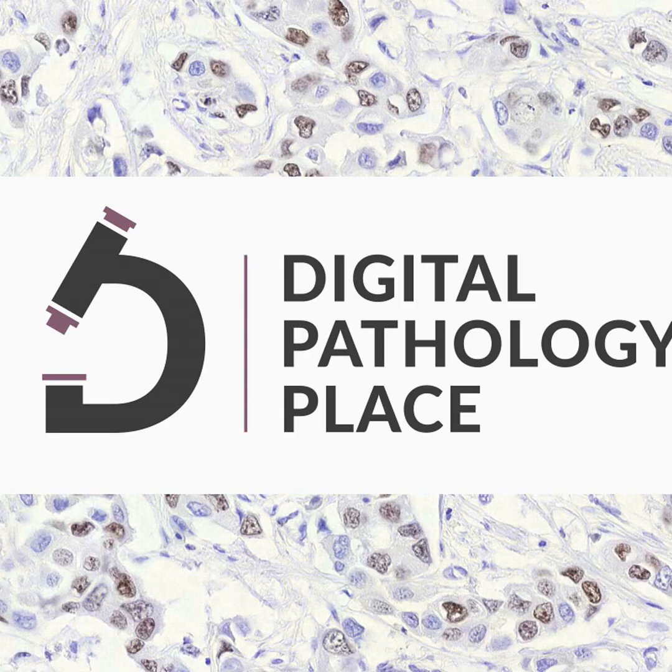This has become that much more important with deep learning, with models with millions of parameters. It's that much easier to overfit. In the more traditional machine learning days, where maybe you're looking at the size of nuclei and shape and intensity, different things like that, it would be harder to overfit to a particular patient or to a particular medical center. But you throw a deep learning model with millions of parameters at it, and I guarantee you it's capable of overfitting to anything that's in there. If there's pen markings circling the tumors, it will learn that. Yeah, I guess often the batch effect causing features are pretty strong and they get rewarded because you can easily distinguish your images by that very feature.